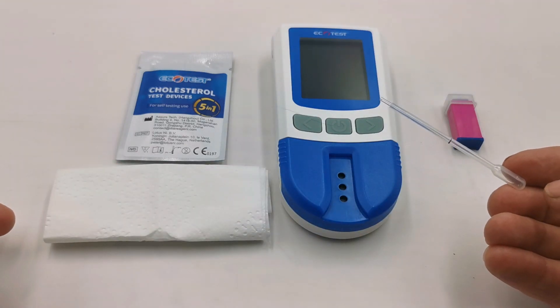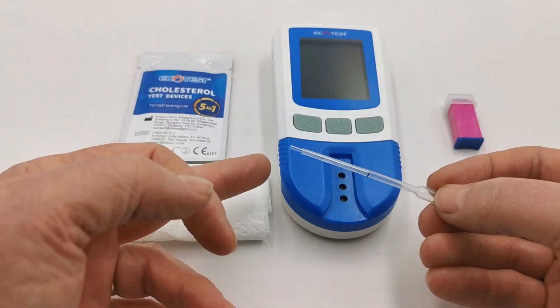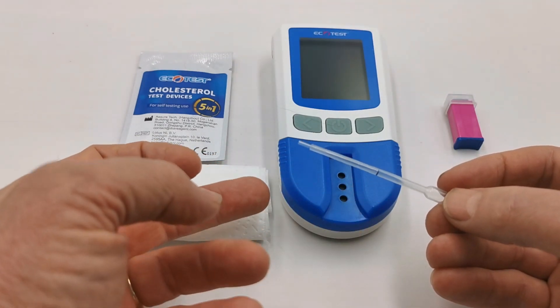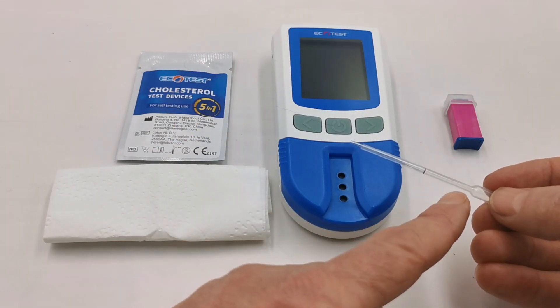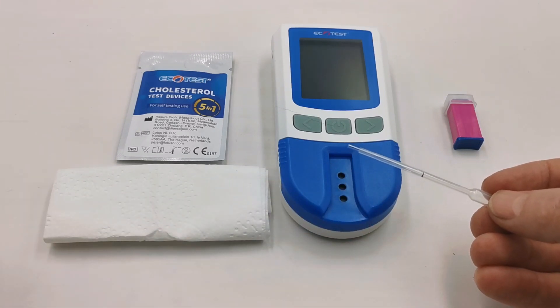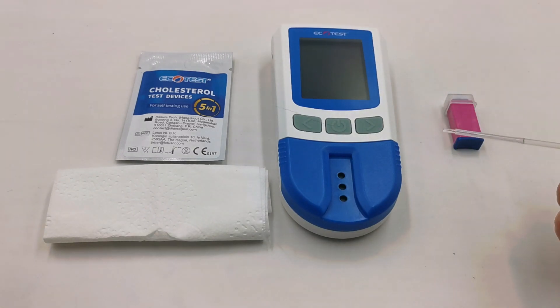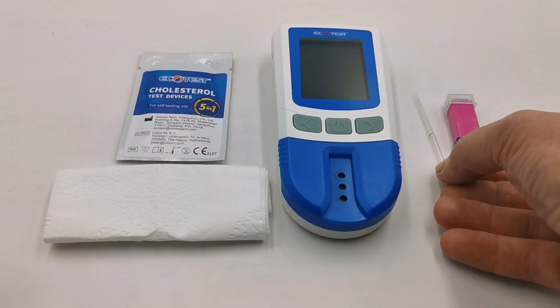The bulb on the end of the pipette is not squeezed to suck blood into the pipette. Simply present it into the blood droplet and the blood will naturally flow into the pipette up to the black line. Continue feeding the pipette into the blood sample until it reaches this line. Do not squeeze the bulb as this will encourage blood air bubbles and the sample volume will be incorrect. The bulb is used to discharge the blood from the barrel into the test device once the sample has been accurately collected.